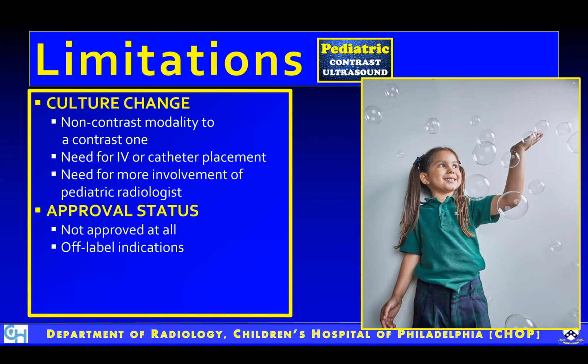And the approval status is always a point of discussion. We're very far now. We already have a contrast approved, but it's not for all indications. Some are off-label. So this is always a point that concerns some colleagues.